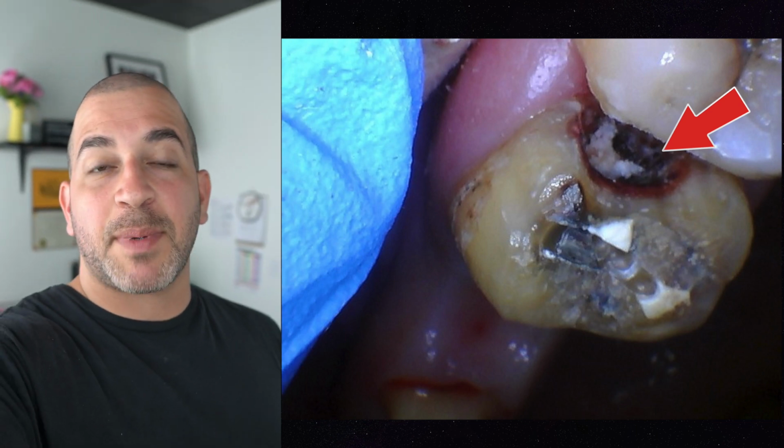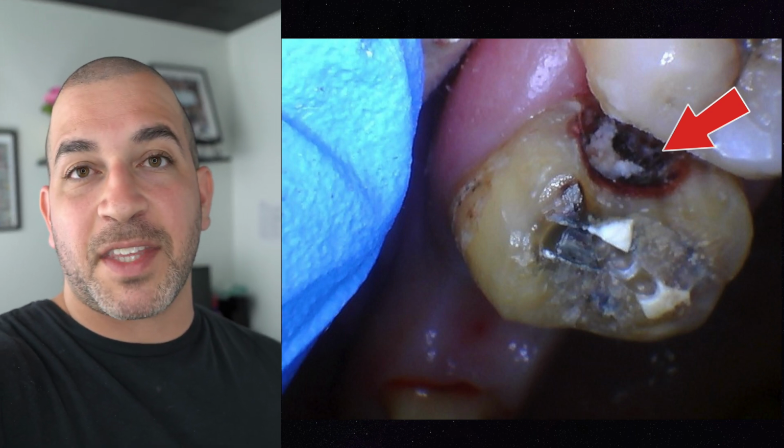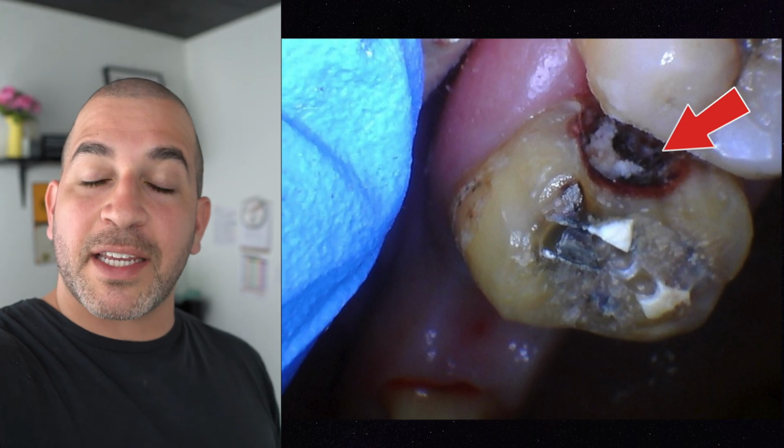After taking our high speed and removing some of that tooth structure, we eventually found the extent of the decay. It is large, it's on the side of the tooth, it's close to the gums, and it's in a relatively difficult area to clean out.